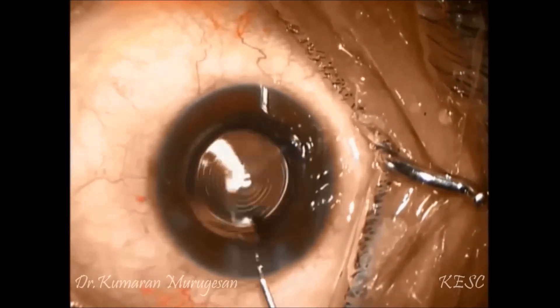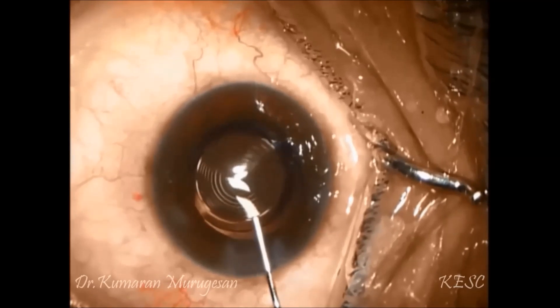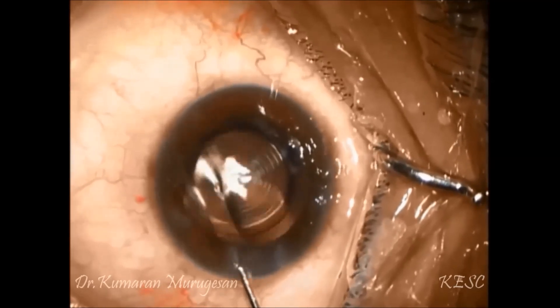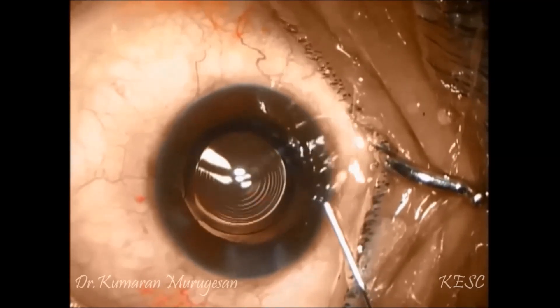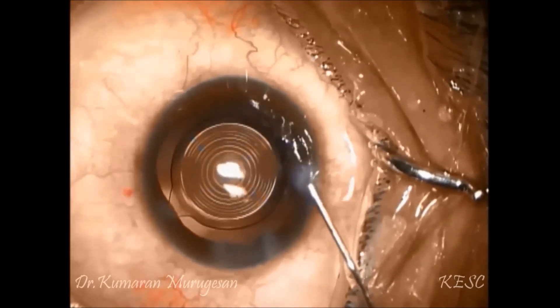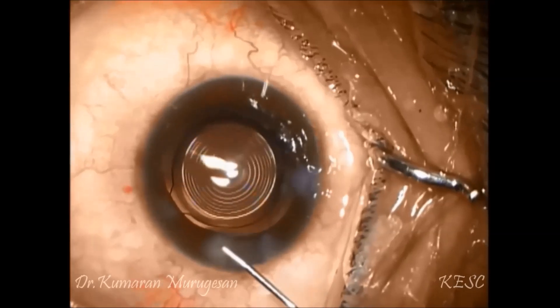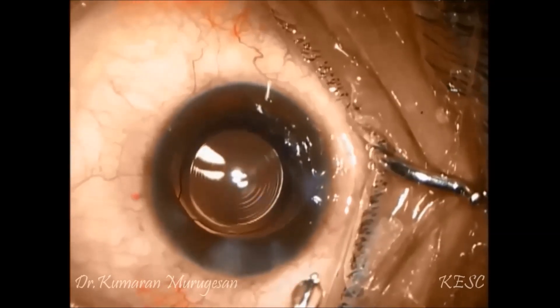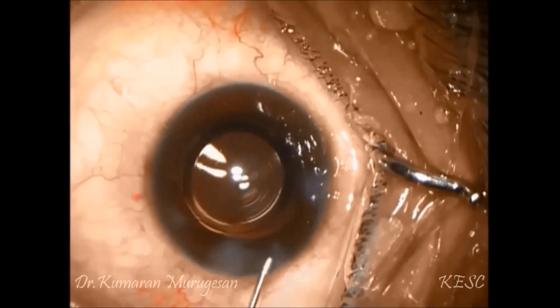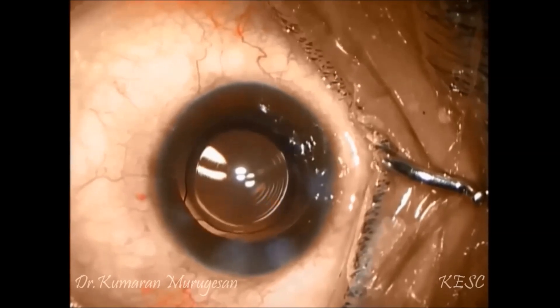Normally, the visual axis is situated 0.3 mm nasal to the pupillary axis. This image shows the IOL central ring placed on the visual axis, which is nasal to the pupillary axis or the center of the pupil.